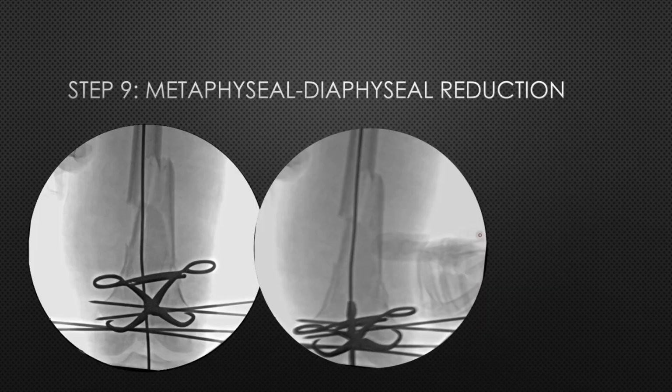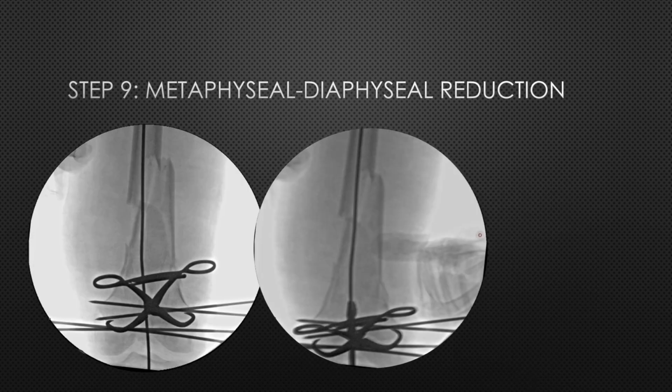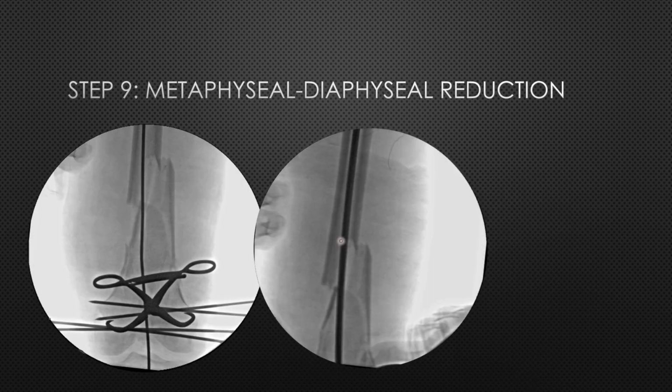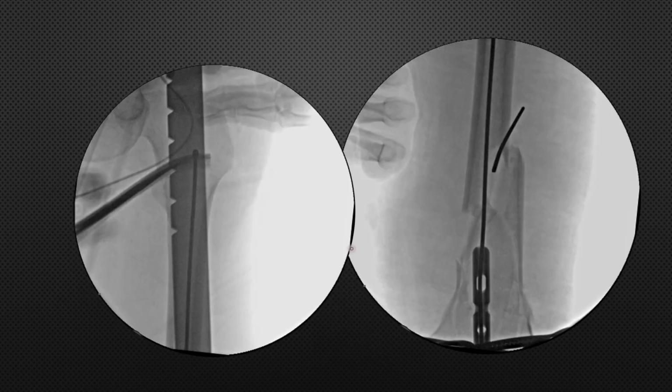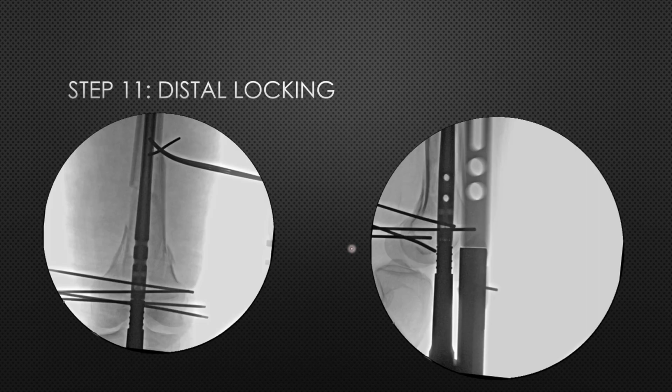Here you see during the process of framing, it was actually displacing. See, the displacement is happening here. So this fragment is unstable. We are not worried about that. That is going to heal by the callus formation. Now the next step is distal locking.